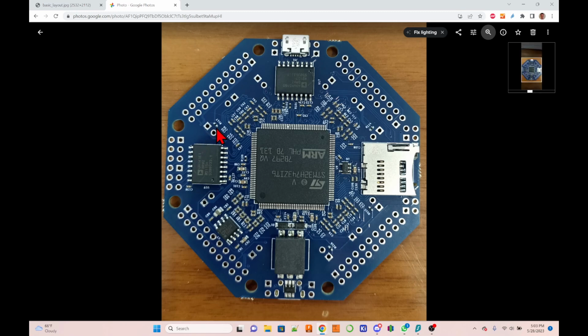But before you do that, there are 4 0 ohm resistors that need to be removed from the board. And just so everyone knows what a 0 ohm resistor means, in order to operate this board by itself, there need to be 4 0 ohm resistors, and I'll show you the position. One is right over here, and what it does is these 2 pins here, when you interconnect multiple boards, these 2 positions and many other positions, with a pin they go directly to the same pins of the other boards. But if you're not using the system in multiples, but just a single system, then 4 of those positions, these 2 pins need to be connected together. They need to be connected with a 0 ohm resistor.